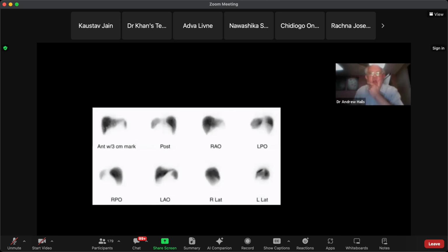Now, I won't ask you about this one. I'll ask you in a minute. But this I was asked to put in, but really it's hardly done at all in nuclear medicine anymore. But I think for some reason somebody got asked about it. But anyway, it's a sulfur colloid scan. So this goes to the liver and the spleen.